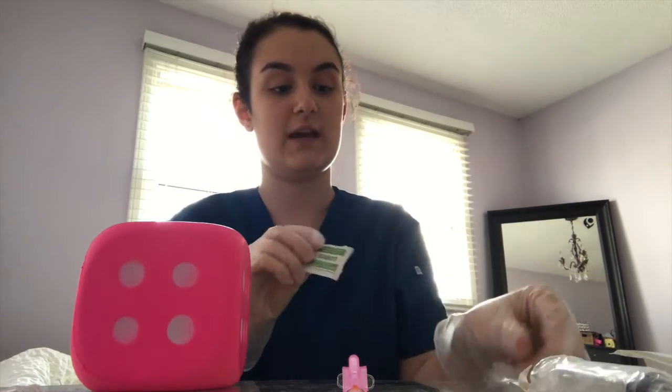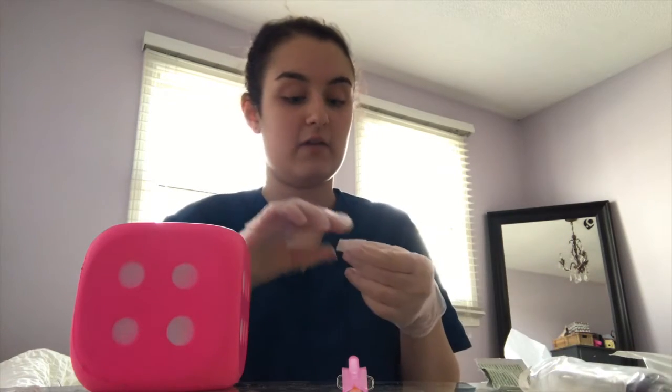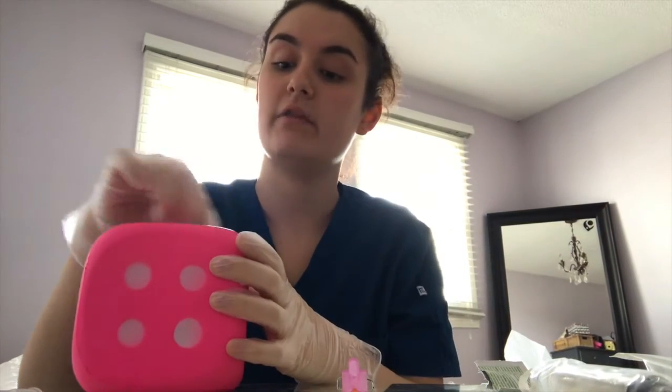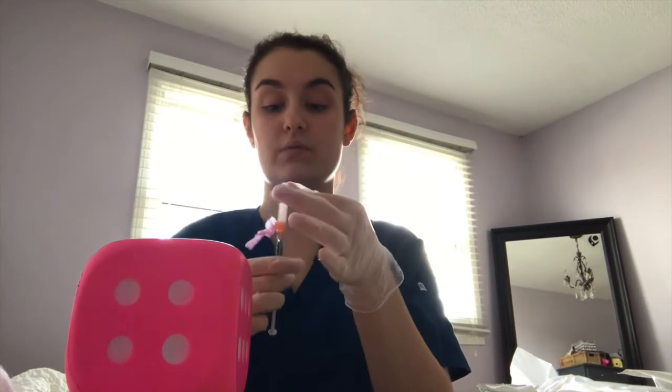So, subcutaneous injections. Let's say that this is the tummy. So, what would I do? First step. Obviously, we're functioning under the idea that I have all of my stuff in a sort of proper format, maybe on a little bedside table that the hospitals have. All prepared. So I'm clean. And now it's clean. I'm going to let it dry. While it's drying, I'm going to get this ready. So subcutaneous. It's dried. It's clean. It's good to go. Now I'm taking off this lid.